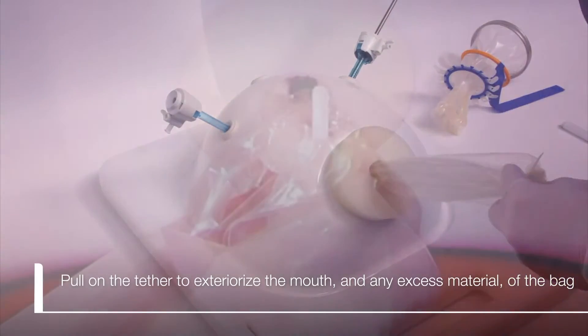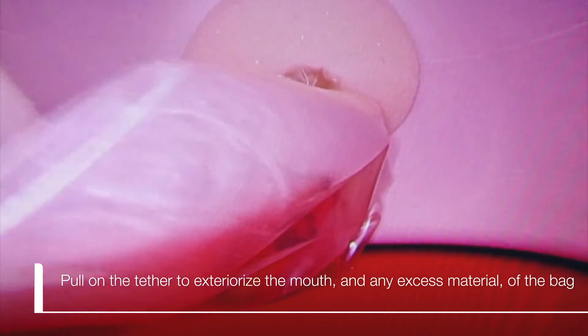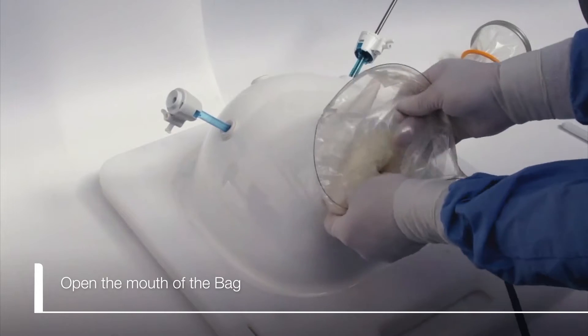Pull on the tether to exteriorize the mouth and any excess material of the bag, then open the mouth of the bag.